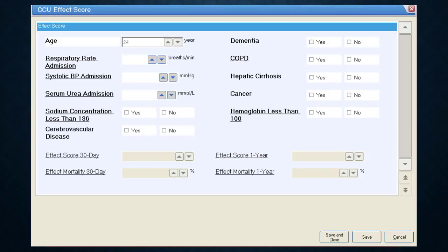Clicking the EFFECT Score button opens the EFFECT score form, which asks questions about the patient's age, admitting vital signs, blood work, and past medical history such as dementia, COPD, cirrhosis, and cancer. These are just drop-down menus and yes/no buttons. Once selected, the EFFECT score mortality at 30 days and 1 year is automatically calculated. Then click Save and Close to complete the form and move on.